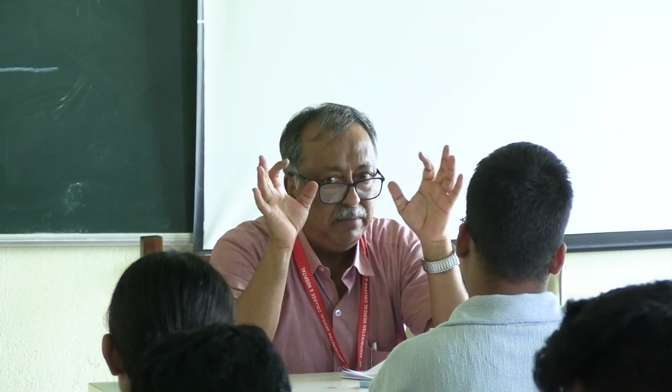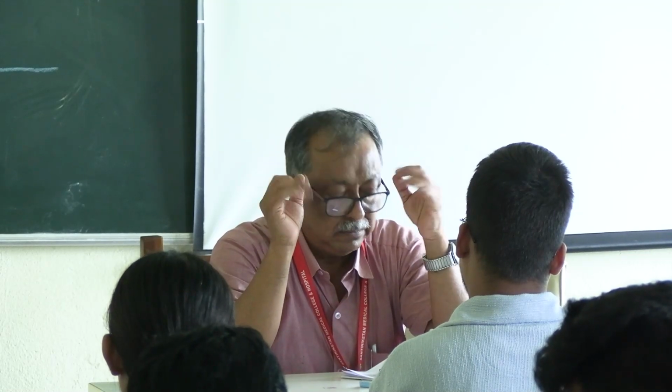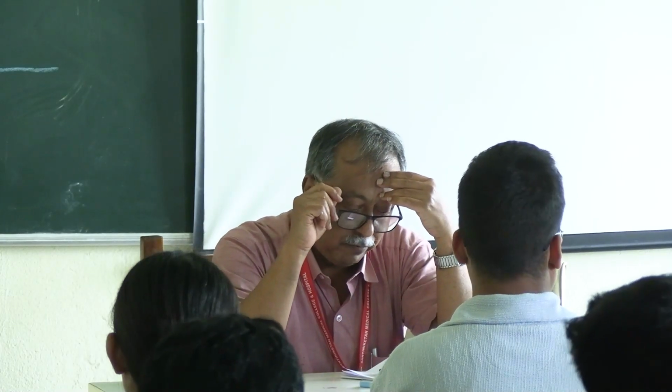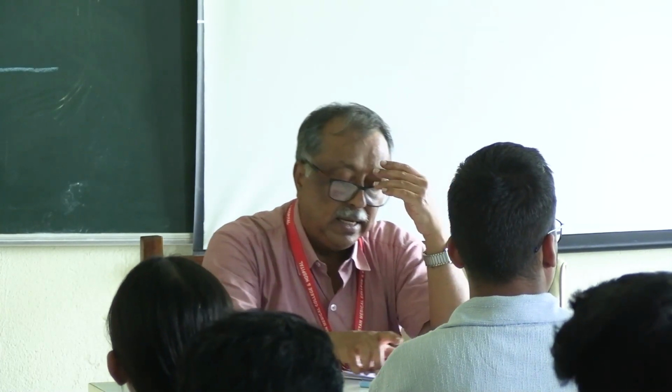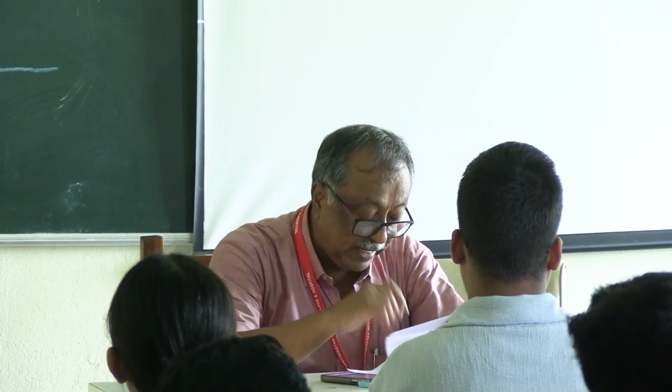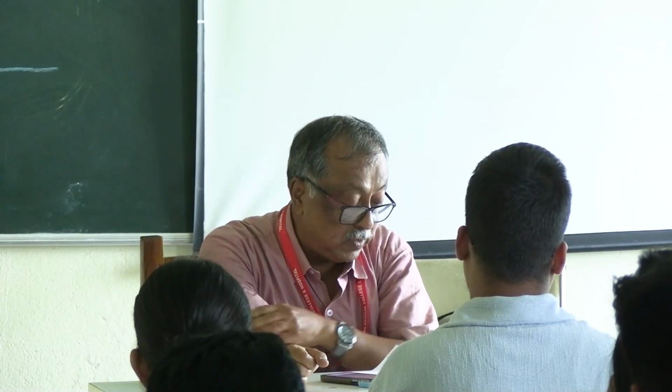They can at least assess that hearing is partly present. Then the voice or the conversation test, the whispering test.